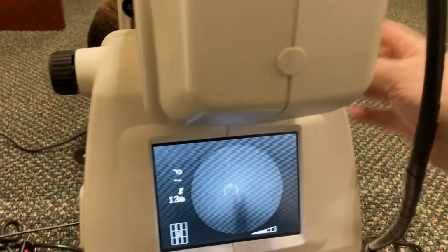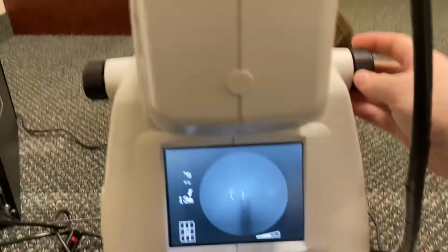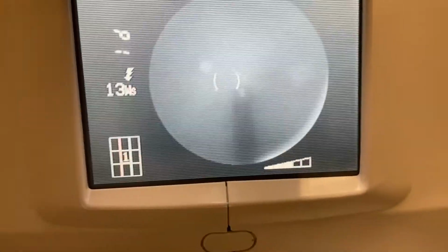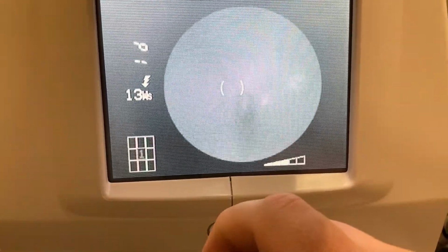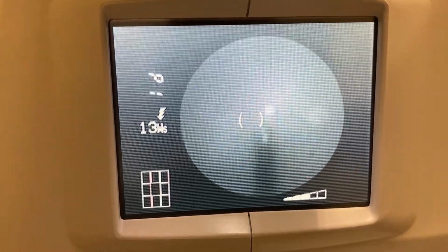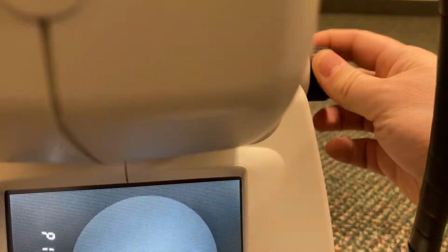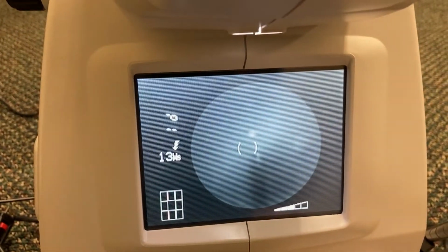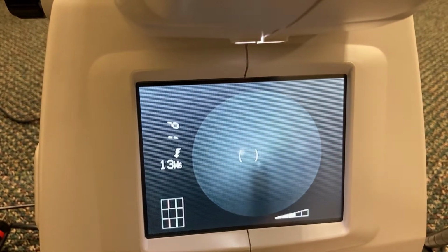And then this knob on the side, it's the same thing on both sides, is going to split these lines apart right here. There's both lines, and it'll split them on both sides depending on where I rotate it. So you rotate it to where the lines are aligned up with each other, and then you push forward and backward till the ghost dots are together, and then you can push the button.